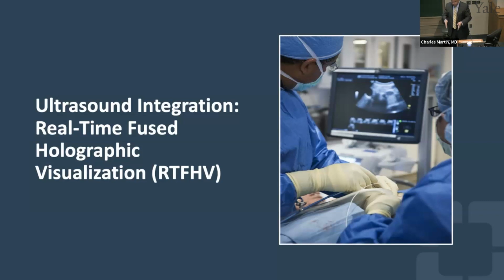You're actually able to physically look at your hands, just like any other operator who does other procedures, and actually perform a procedure, minimizing drift, minimizing all of the fine motion that we as IRs just take for granted, and that we're able to get over time.